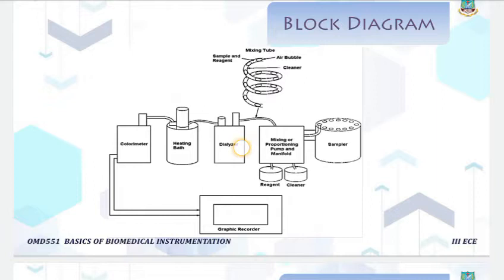Here it will allow only the selected sample components to pass through the semi-permeable membrane.